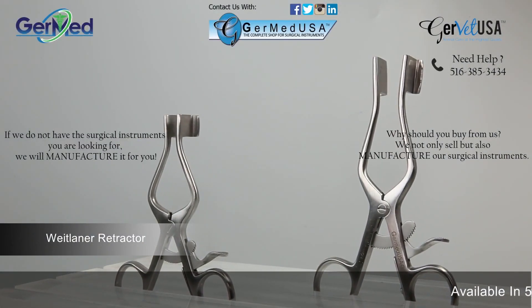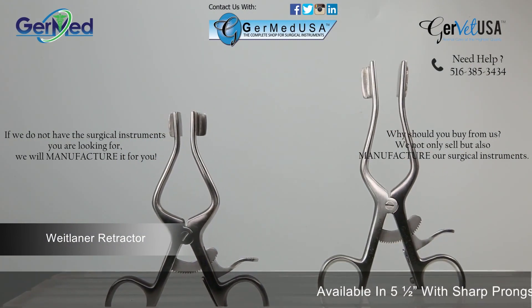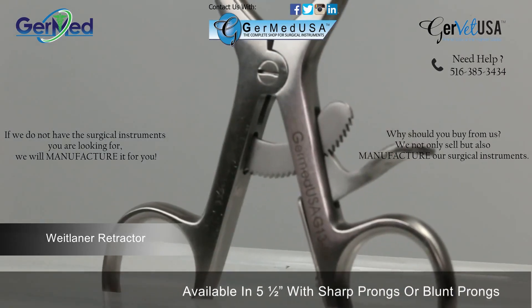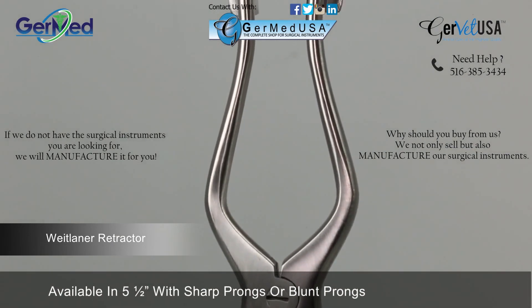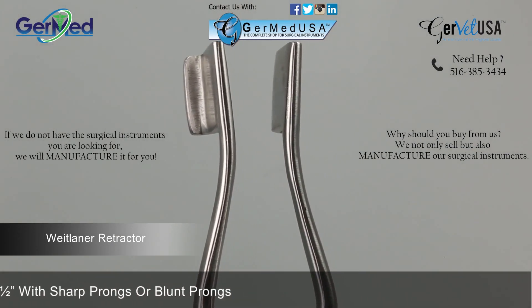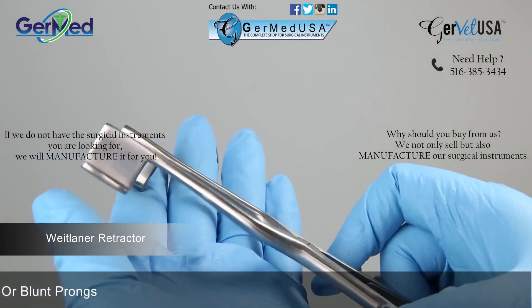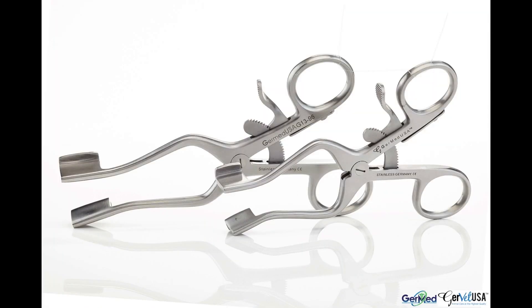GermEd provides Wheatlander retractors in sizes four and a half and five and a half inches. A Wheatlander retractor is a self-retaining finger ring instrument used for holding back tissue and exposing a surgical site on small surgeries. The retractors feature a solid blade.